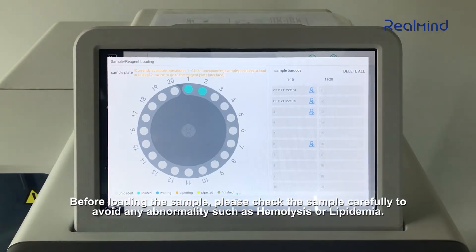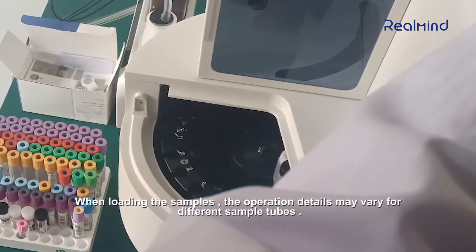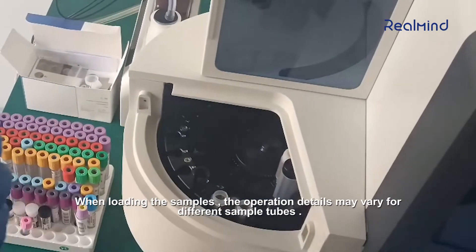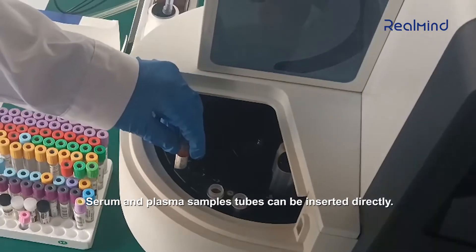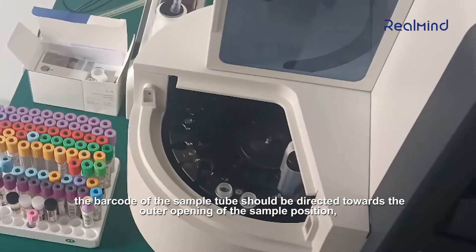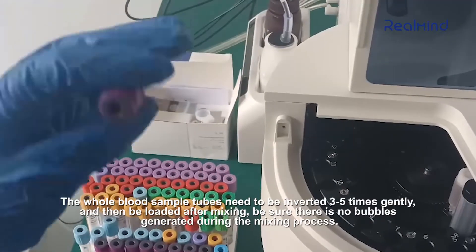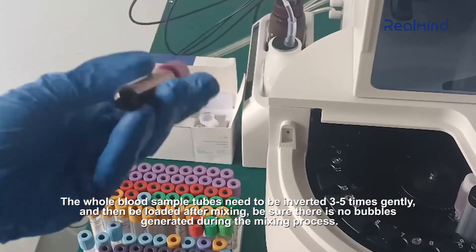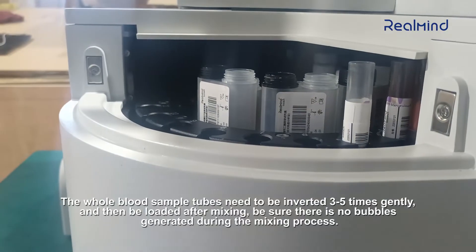Before loading the sample, please check the sample carefully to avoid any abnormality such as hemolysis or lipidemia. When loading the samples, the operation details may vary for different sample tubes. Serum and plasma sample tubes can be inserted directly — the barcode of the sample tube should be directed towards the outer opening of the sample position. Whole blood sample tubes need to be inverted three to five times gently and then loaded after mixing. Be sure there are no bubbles generated during the mixing process.